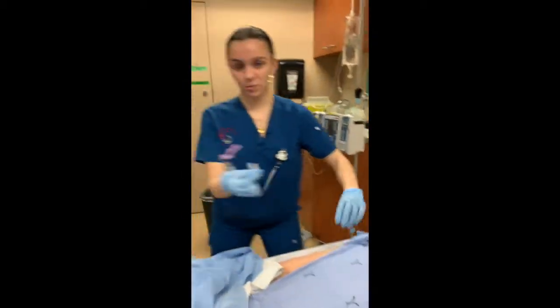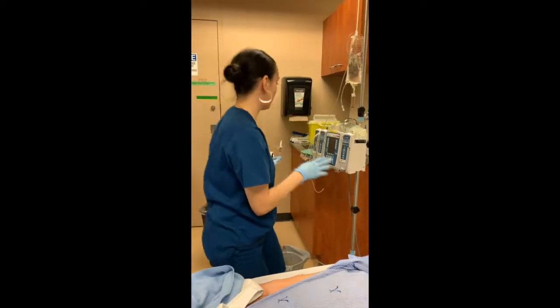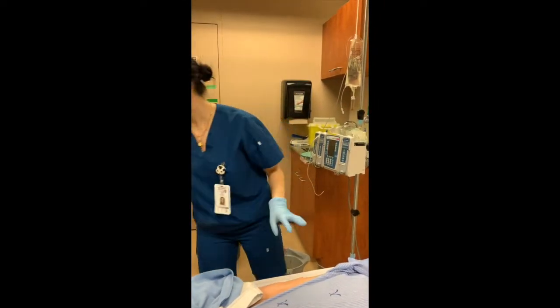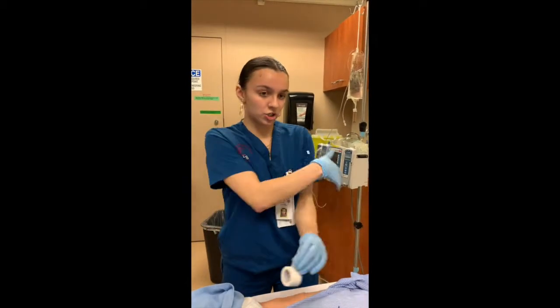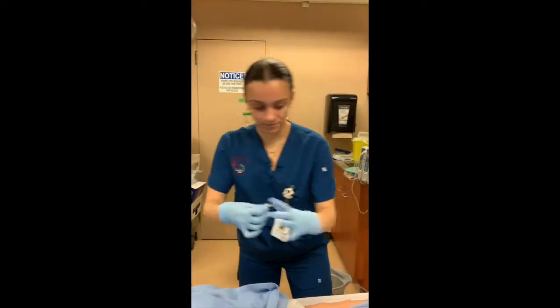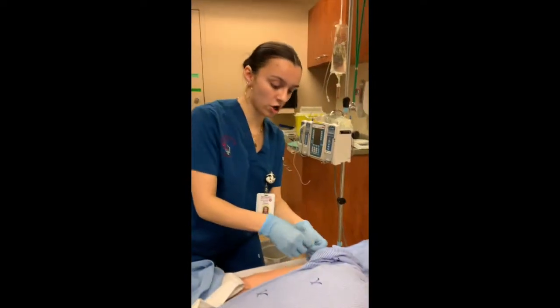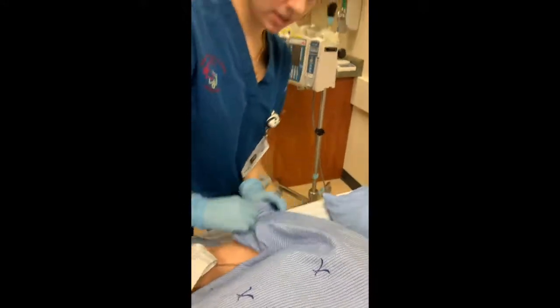What you want to do after, you want to put the cap back on, and then like for the subcutaneous, you're going to put it in the sharps bin. I'm also going to, usually you would put a cotton ball or something much softer underneath the tape just to cover the incision area. All right. So I would just put it on the arm, just like right here. Okay.